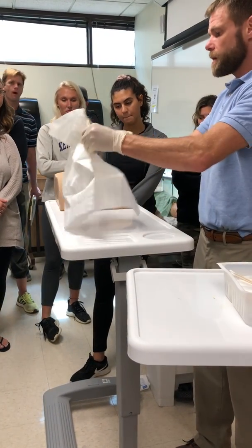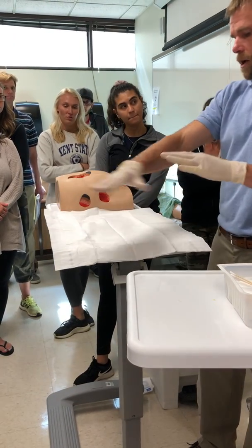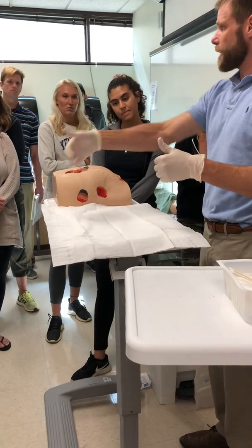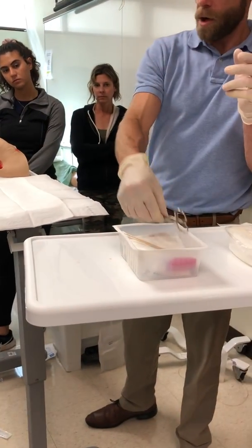So I always like to grab all my stuff, so I do stuff like this. The drape cannot hang over the edges. This is okay, but it can't hang over the edge where I can't see it. I need to be able to see everything that's in my sterile field. And then I'm going to start adding stuff to my sterile field.